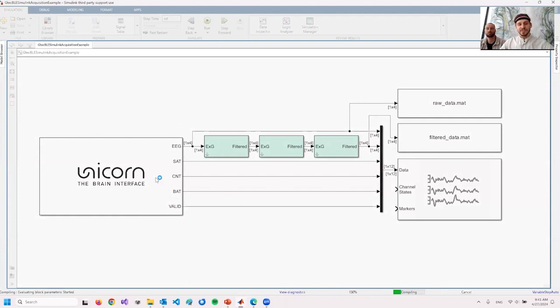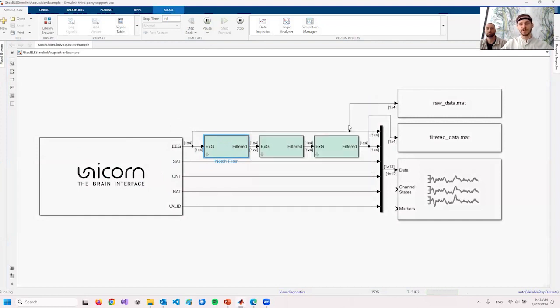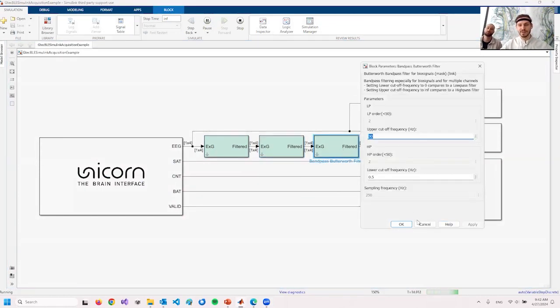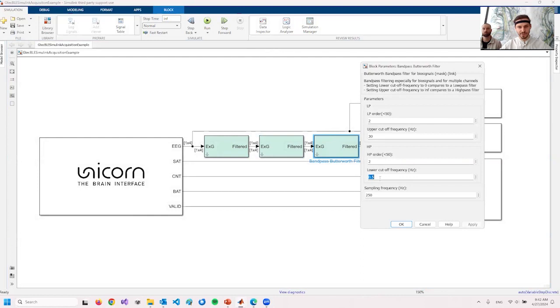What I'm doing right now is, as mentioned before in the presentation, pre-processing EEG with a 50 Hertz notch filter, because I want to remove the power line hum, or a 60 Hertz notch filter if I would use it in the US. And then we have a bandpass filter where I'm cutting the signals from 0.5 to 30 Hertz. I'm using dry electrodes right now, so I might want to go from 2 to 30 Hertz, for instance.